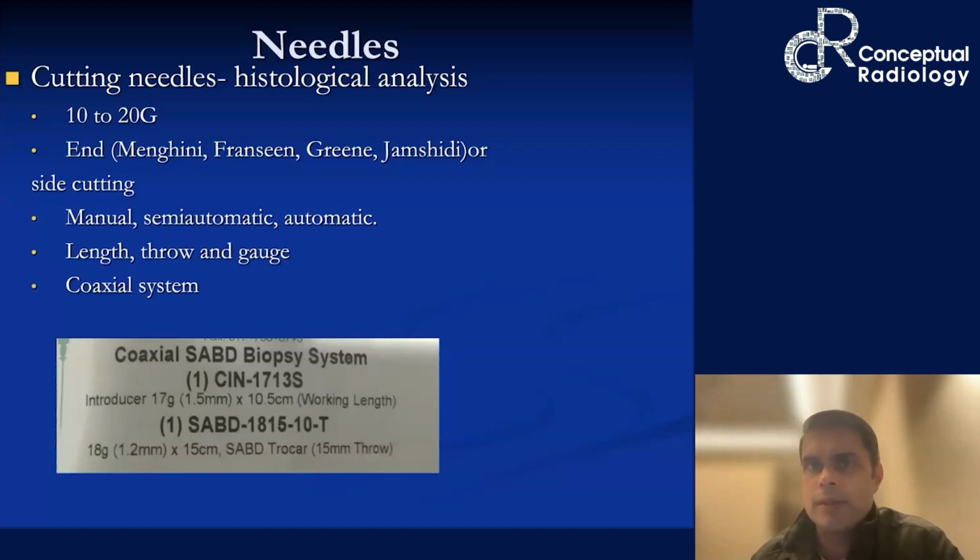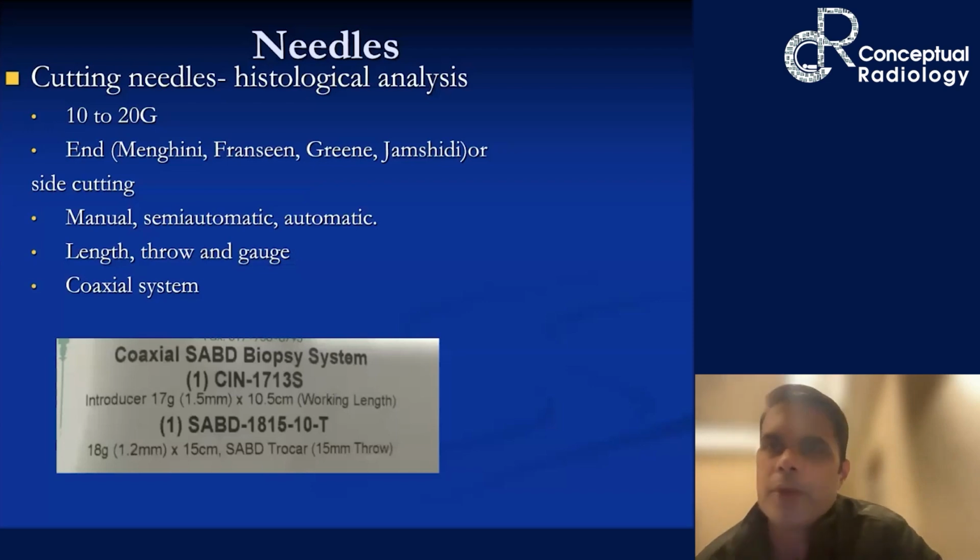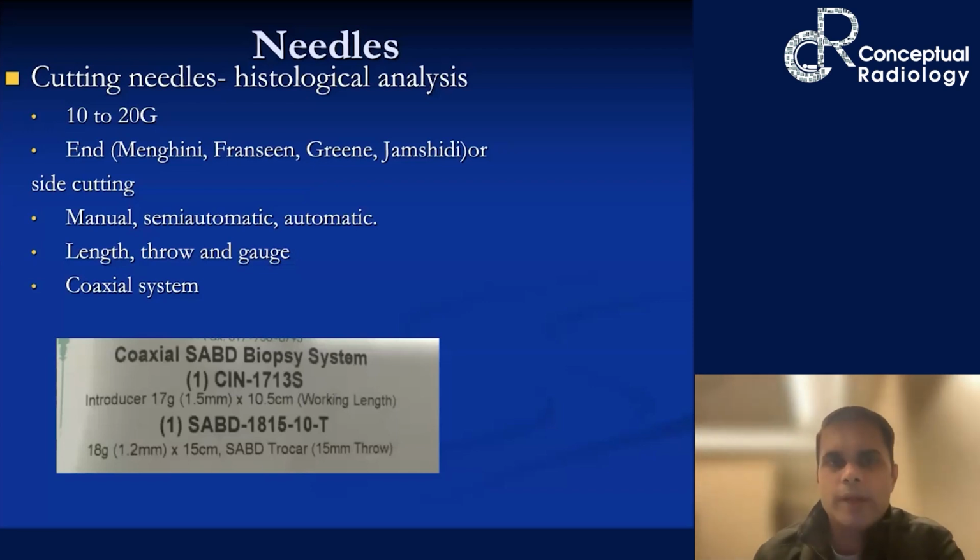But if it's about lung biopsy, or liver biopsy, visceral organ biopsy, kidney biopsy, so there are the places that we usually always try to take a coaxial system, because it is just so much easier. And once you have the position in place, you don't have to again and again see in the ultrasound whether I have to do it all the way up, because sometimes there's fat in between. Access is not always easy. You don't want to repeat the imaging over and over again.